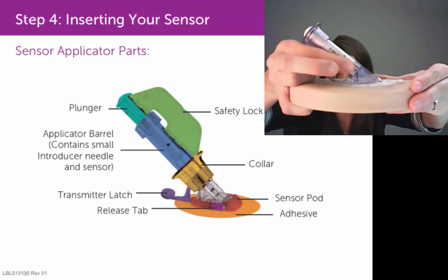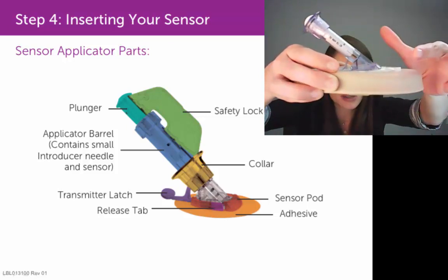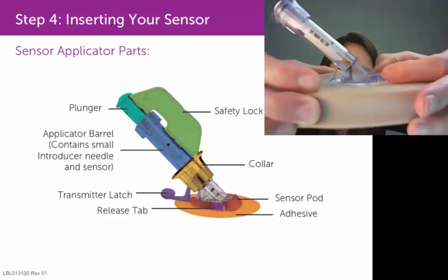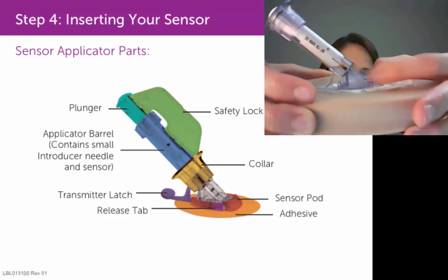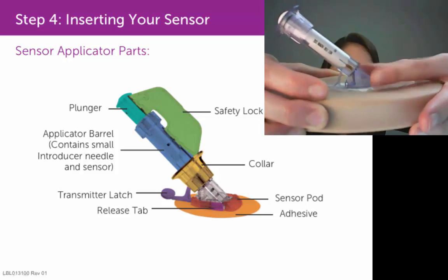You then need to remove this applicator barrel from the sensor pod. Take your thumb and index finger and feel for these release tabs — these little ridged tabs on each side. They're a little hard to see.